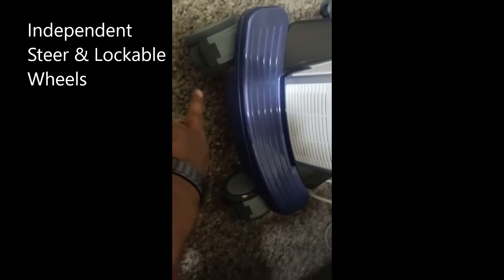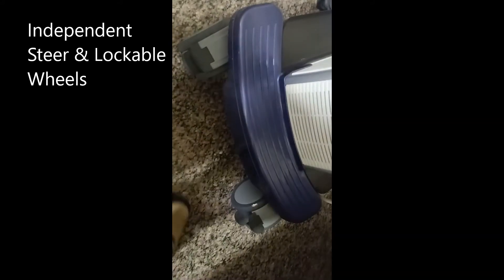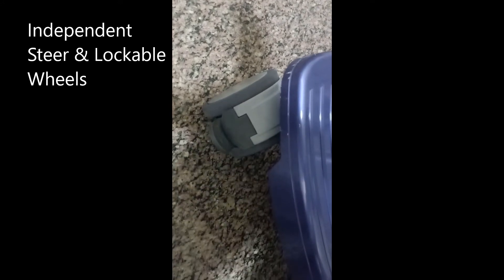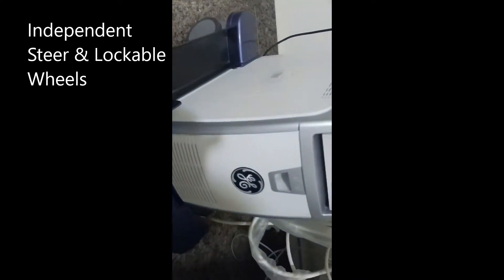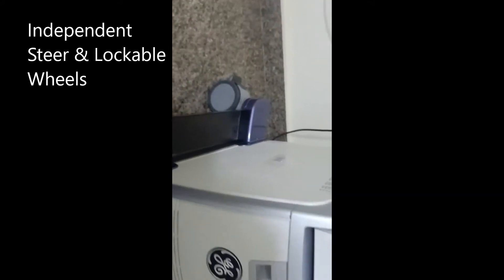In this machine we have lock and unlock switches. If you press this it will be locked, and you can use it to unlock as well. Here also you will get the lock and unlock switches.